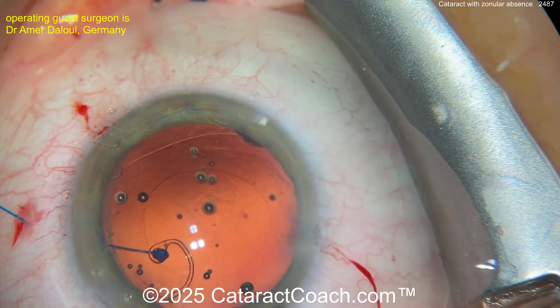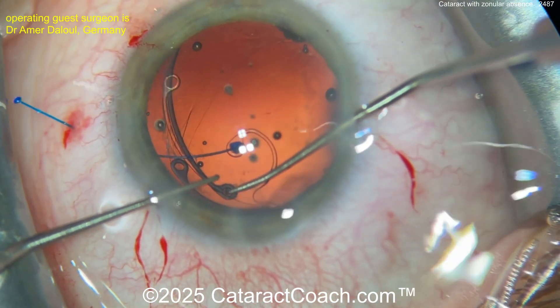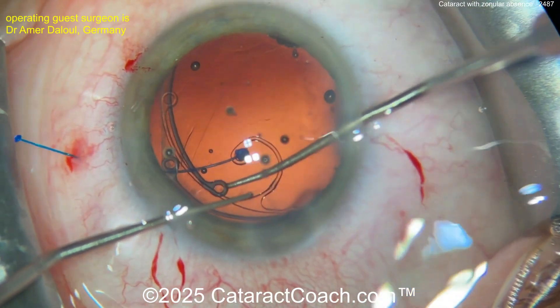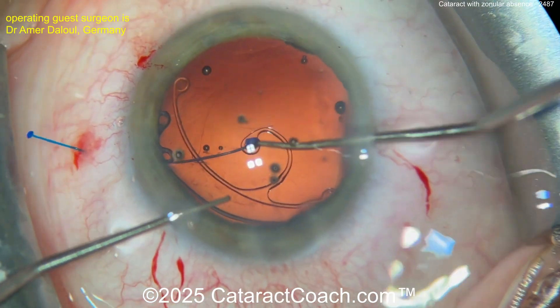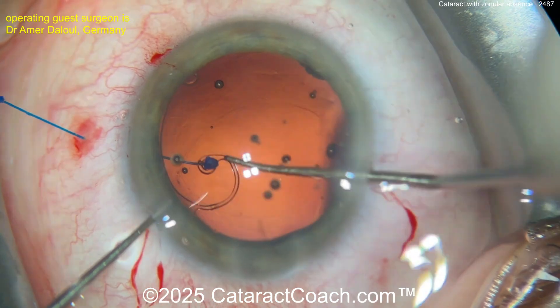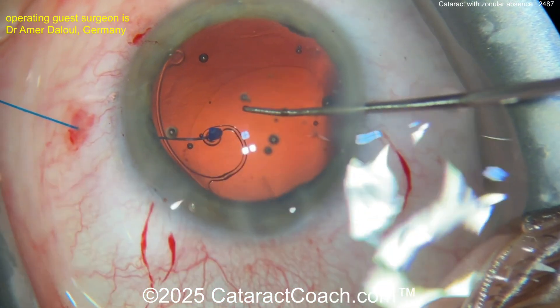You may have to trim that a little bit more. Now going in with a CTR in the bag as well — be careful, don't get them too locked into each other. The capsular tension segment and the CTR sometimes want to bump up against each other. A cohesive viscoelastic really helps with that. Good job — CTR went into the capsular bag. You've got the CTS there, now stabilizing things.